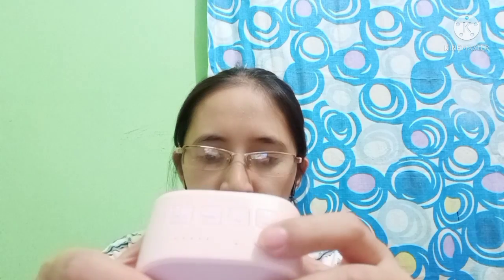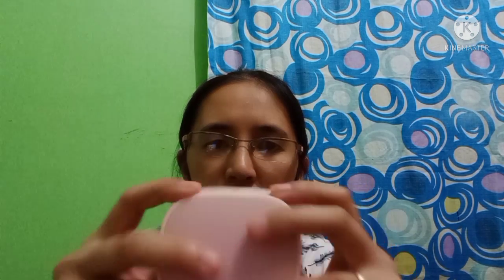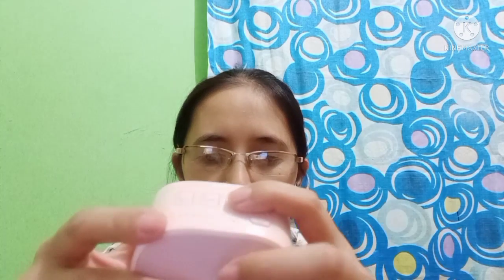And then, of course, punta tayo dito sa kanyang motor. Ito yung motor niya. Ito yung on. Ayan. Dito natin siya ino-on. And then, this is the battery indicator. Ito naman yung level indicator. And then, this is massage button. This is the expression button. Tapos, ayan. Level down, level up. And then, andito yung kanyang USB port para sa pag-charge. Ayan. So, let's turn it on to see how this works.